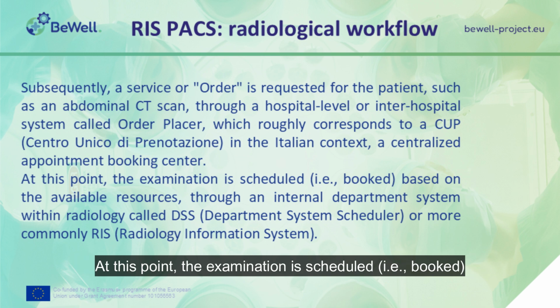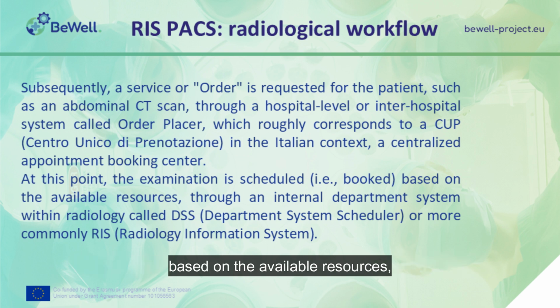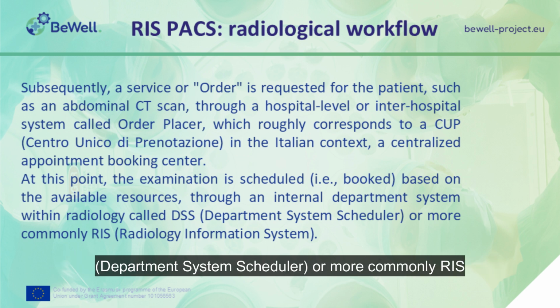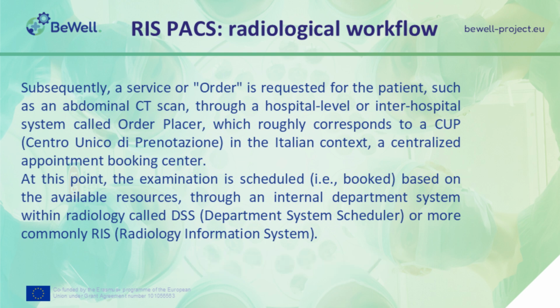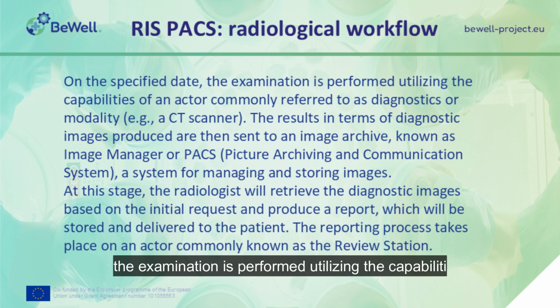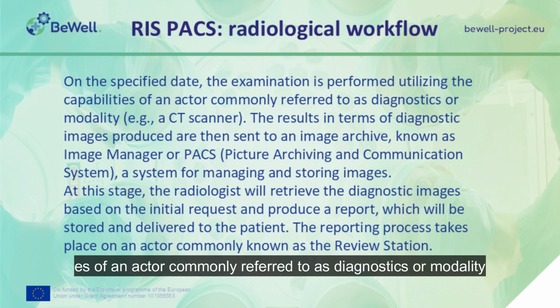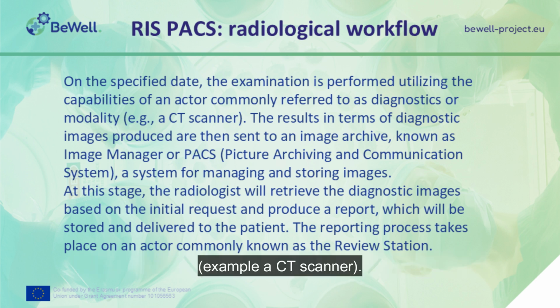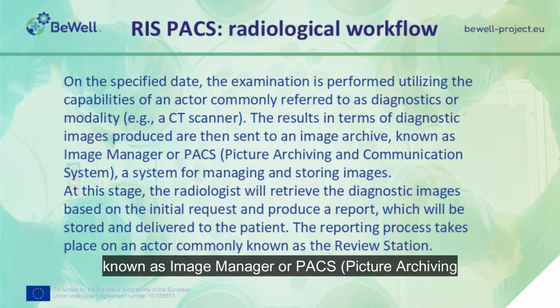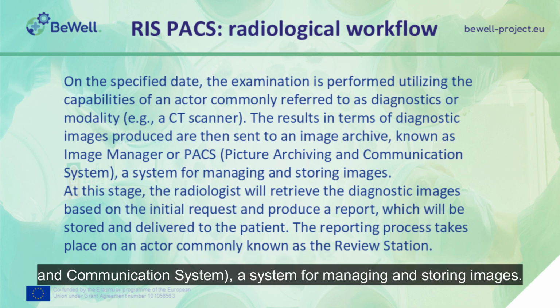At this point, the examination is scheduled, i.e., booked, based on the available resources, through an internal department system within radiology called DSS, Department System Scheduler, or more commonly RIS, Radiology Information System. On the specified date, the examination is performed utilizing the capabilities of an actor commonly referred to as diagnostics or modality, for example a CT scanner. The results in terms of diagnostic images produced are then sent to an image archive, known as Image Manager or PACS, Picture Archiving and Communication System, a system for managing and storing images.